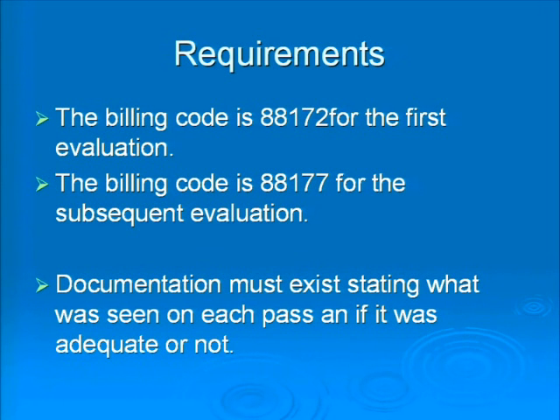So as you get into this and you start to do more and more looking at slides and staining and things like that, just remember that just like you do for your ultrasounds and your procedure notes currently, you have to have justification for why you do each additional pass if you want to get paid for them. That's all I have from this, and we can go through any more of this when we get across the hall.